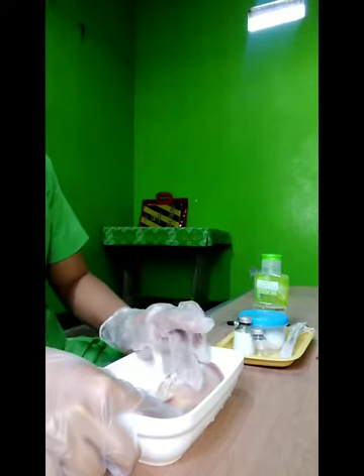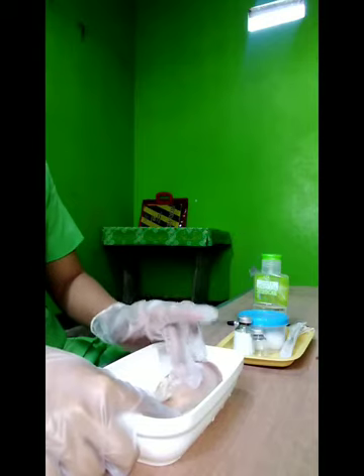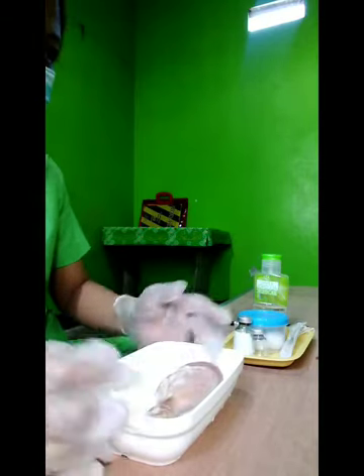Assist the patient to the appropriate position for the site chosen. Drape as needed to expose only the area of the site to be used.